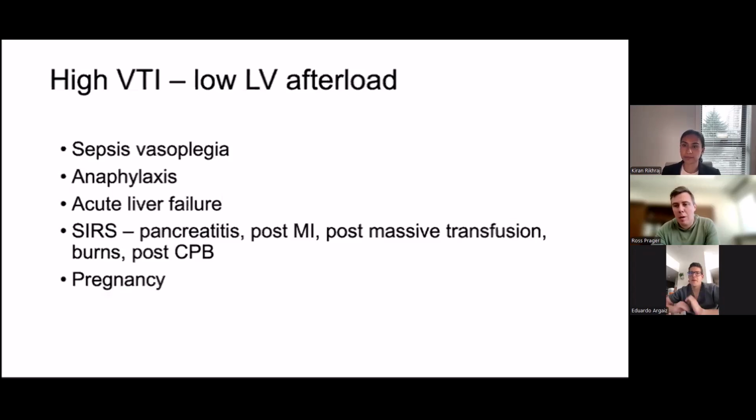Yeah, I mean, it varies. It depends on whether I'm doing critical care or I'm doing nephrology. It's very different. So if I'm approaching shock, which I sometimes do on the primary team, then yes, the main decision point would be: is this patient with hypoperfusion having a very low cardiac index, and could that explain the hypoperfusion? And then of course, if the minute VTI is high, then you're in an easier pathway to make a correct diagnosis.